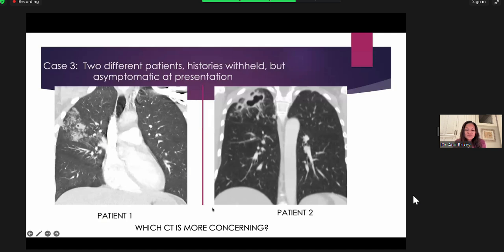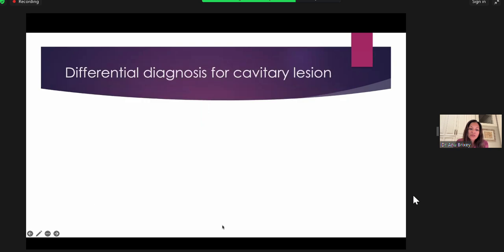So now the question is, which one is more concerning? And if I were looking at this, the one that I would be more concerned about would be patient 1. Okay, so now let's talk about this.